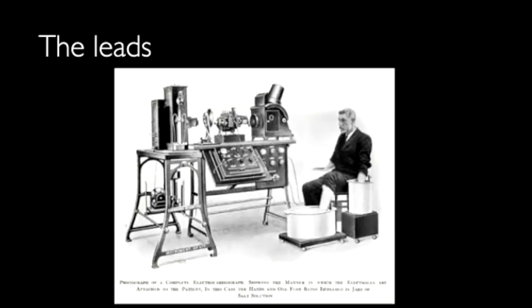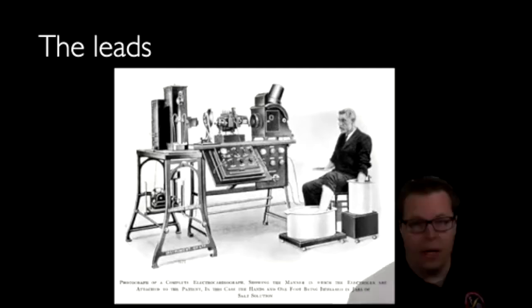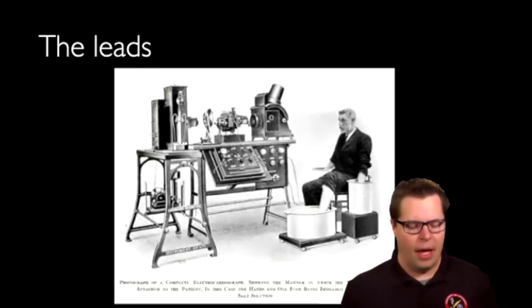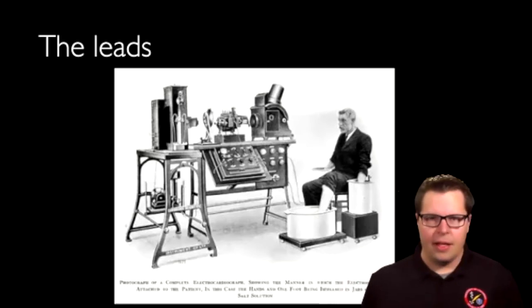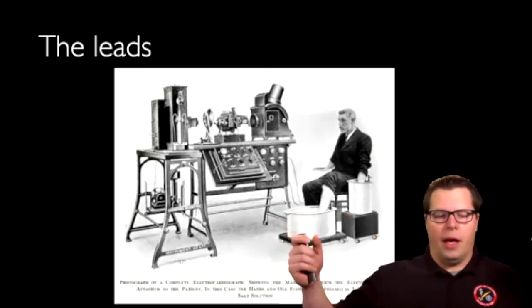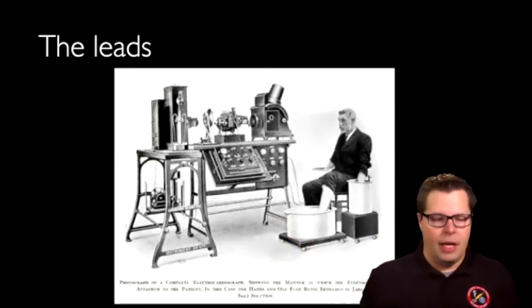That sounds sort of similar to the leads that we put on people, right? And then you may ask, well, what's his right foot doing? His right foot is technically grounded, although not all that well. You get a little bit of a better picture when you put in a ground. But this is the early EKG. It's the same leads. It's a right arm lead, a left arm lead, and then a left foot lead.